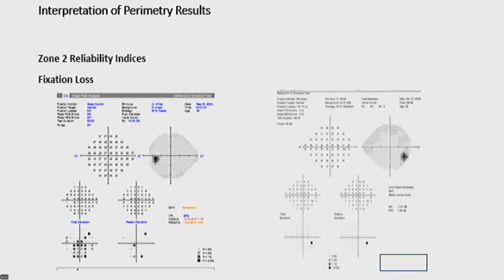This picture shows that when we are interpreting a central visual field test, it's important to determine the position of the blind spot. As is seen in this second picture, the blind spot for this patient has come down from where it should ordinarily be, which is on the horizontal meridian, about 12 to 15 degrees temporal. This is important in determining the validity of this test result.